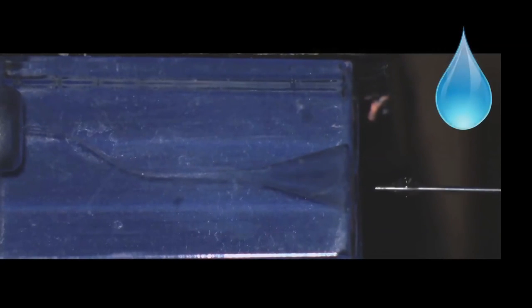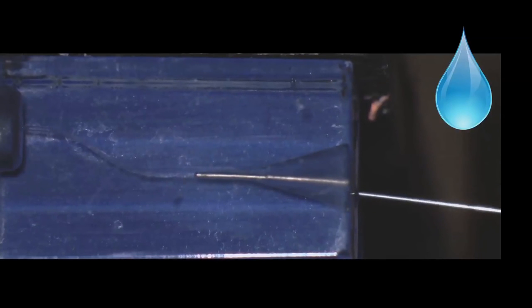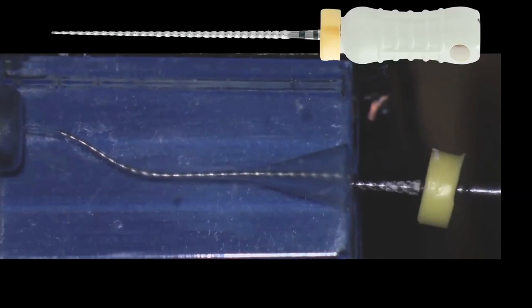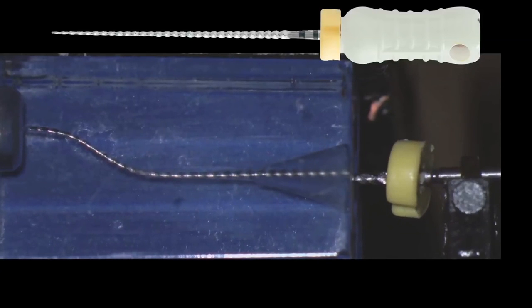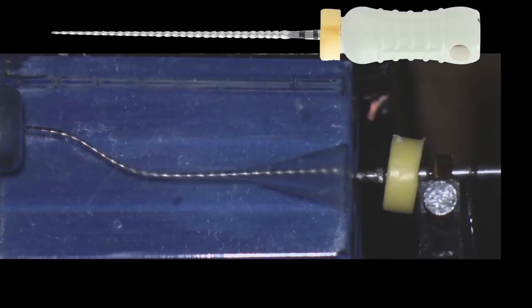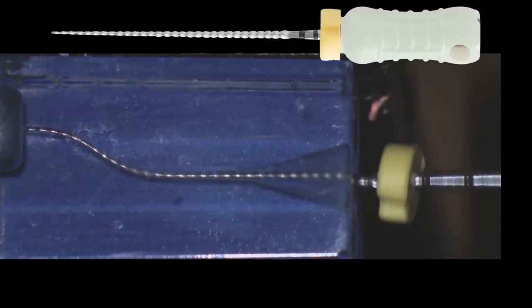We irrigate again. Every time that a file is used inside the canal, it requires irrigation. You can see here how far the irrigation needle goes. Now we establish that working length. Here you can see that the instrument is very, very tight. We're almost at working length. We attach a clip for the apex locator. You are going to start hearing now when it gets to the apex right there, beep, beep, beep. That means that we have achieved that vertical dimension with the electronic apex locator.